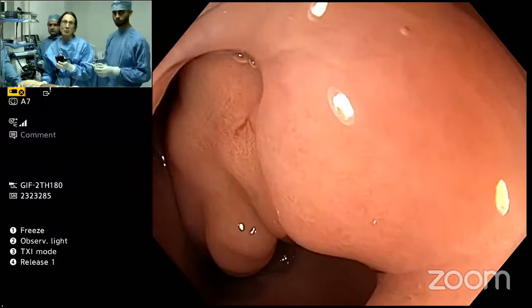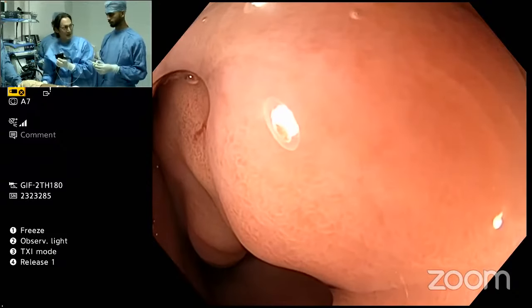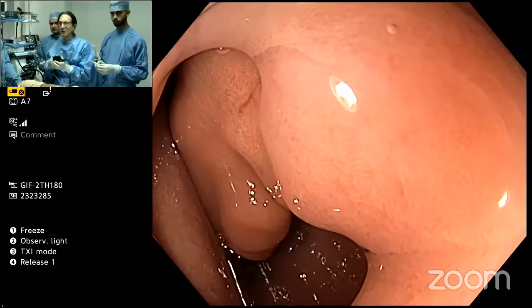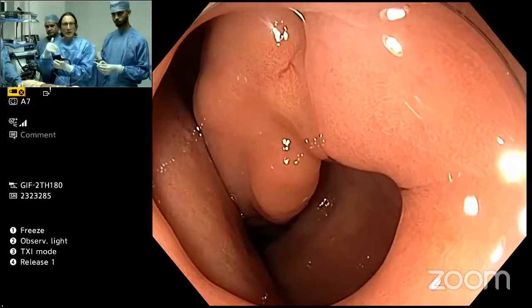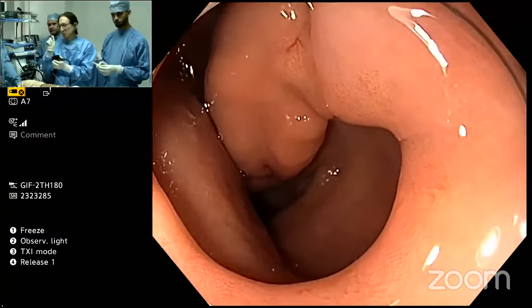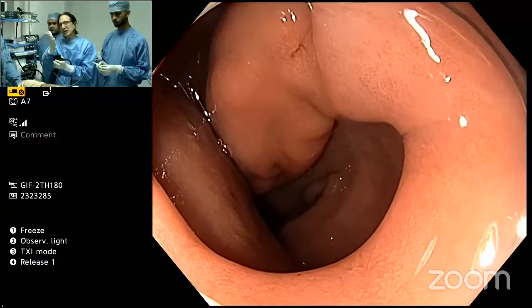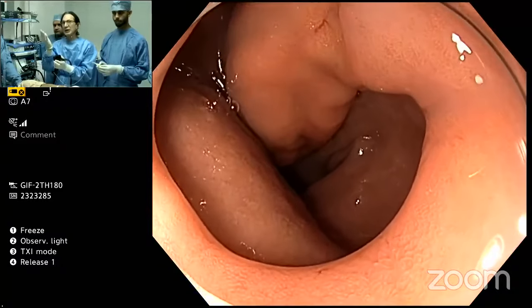So my bet would be, if we had a mini probe here, I don't think we do, mini probe EUS. We have one in our unit. I use it all the time. The mini probe is no different than a catheter. Put it down, and then instantaneously, you don't have to have a dedicated echo endoscope, right? You can just put the mini probe down your working channel and switch on the ultrasound, and then you'll see this is probably going to be an echogenic lesion. And then you have your diagnosis.